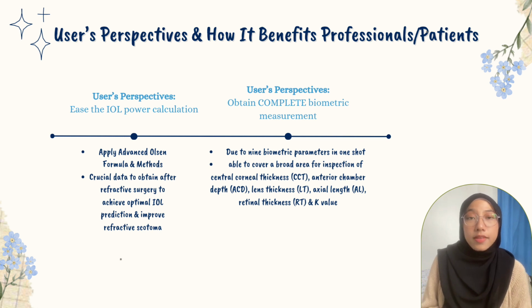Last one, Lenstar LS900 obtains complete biometric measurements that cover CCT, ACD, LT, axial length, and retinal thickness due to the 9 biometric parameters in one shot. Now, I pass this to Sister Rahima for the conclusion of this presentation.